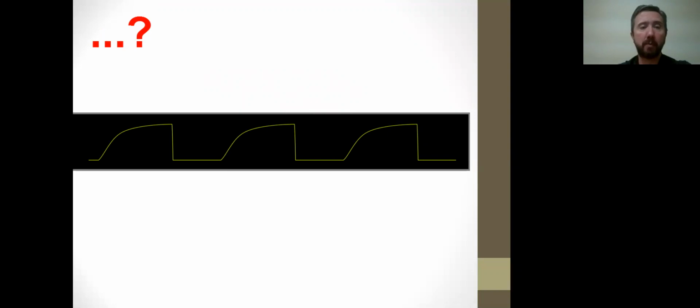So as we continue on with that specific scenario on asthma, what we suspect, history of it, we're starting to see the frequency of the waveform change, but the appearance does not. Now we start to see an increase in end-tidal CO2 and a decrease in respiratory rate. That is a critical clinical hallmark criteria of an asthmatic patient with impending respiratory failure if we don't act quickly. And we're going to talk about that and a whole lot more on this specific presentation.